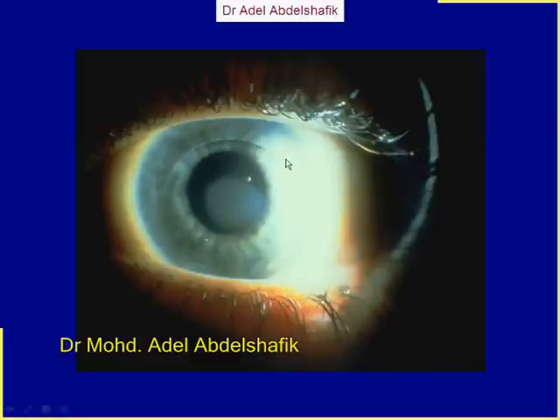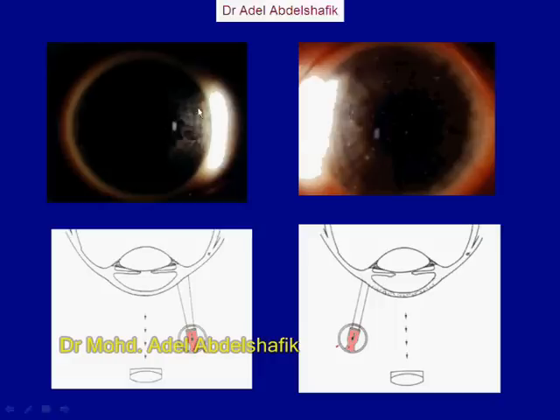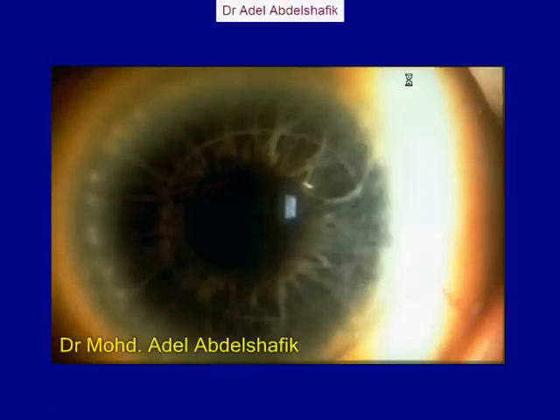Here, light on one side and the opposite limbus is illuminated, and we can see some ring here. Again, light on one side, opposite is illuminated, and you can see some dots here in the cornea. So we call this sclerotic scatter.